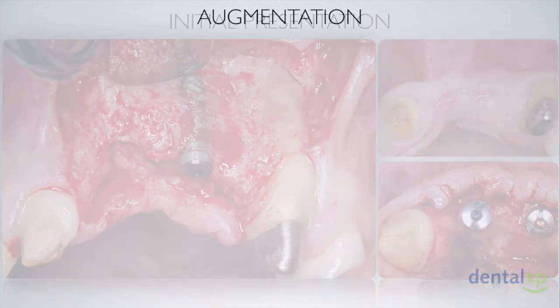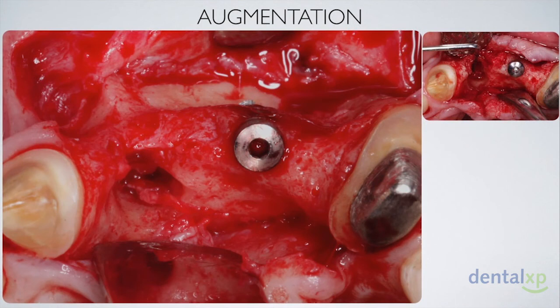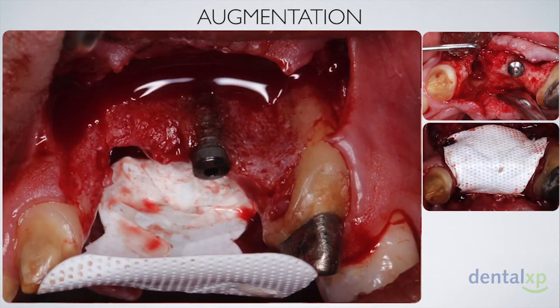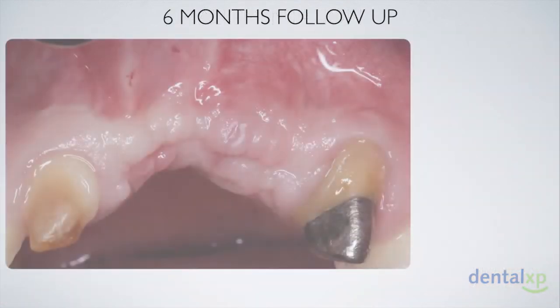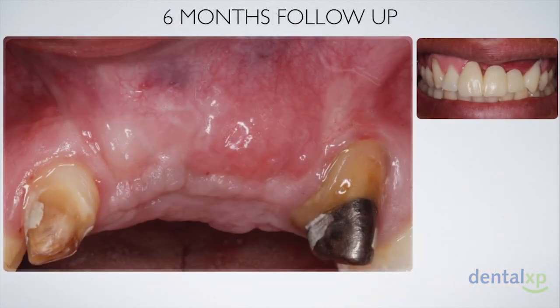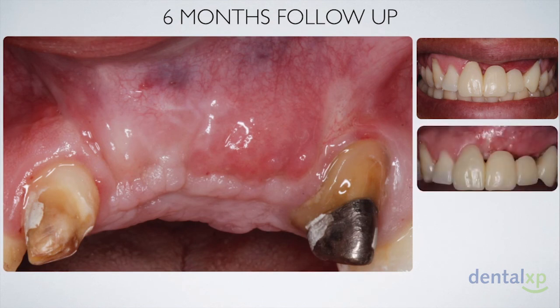The one in number 10, however, seemed to have a thin layer of bone on the buccal to that implant, so a decision was made to augment over both sides. I did not want to be personally the one who removed the implant and was not able to achieve anything after. So a cytoplast membrane was used with a mineralized bone allograft and 4 fixation screws to ensure stability of this graft during the healing period. And this is the pre-op situation, and this is our 6 months post-op of the case.